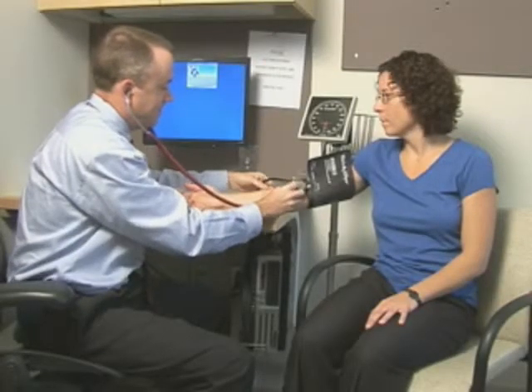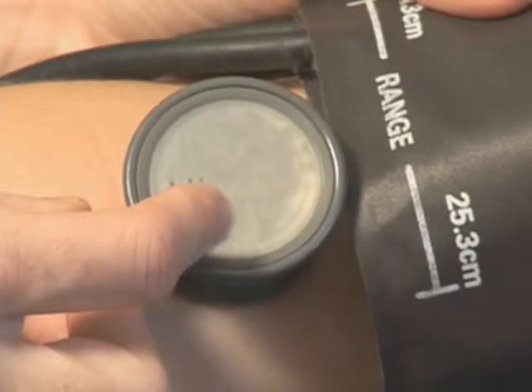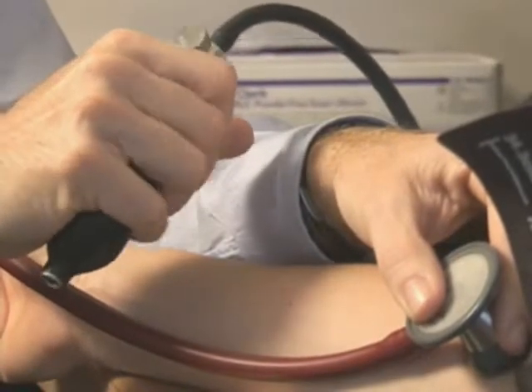Evaluation of blood pressure is essential in assessing cardiovascular health. It is used in screening for hypertension and for monitoring the effectiveness of treatment in patients with established hypertension. In the routine outpatient setting, blood pressure is measured indirectly. Thus, it is important that proper techniques be used in order to produce consistent and reliable readings.